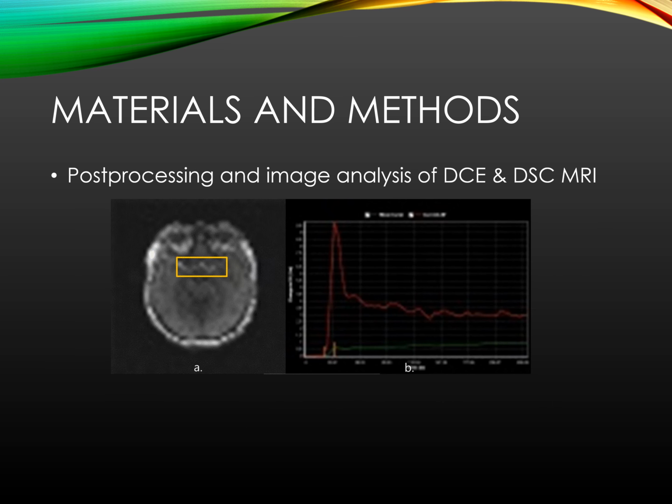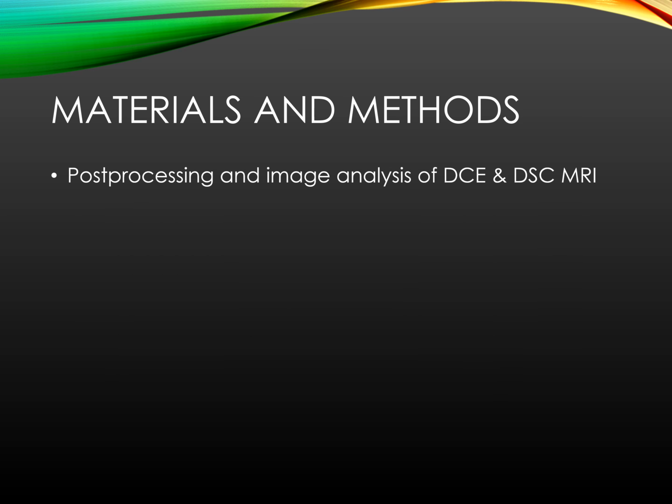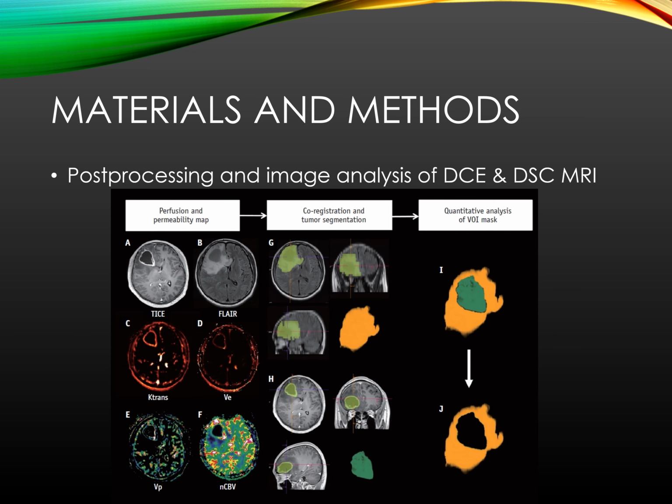This figure illustrates the schematic diagram of the image processing. Two reviewers manually determined the arterial input function, AIF, by locating an ROI at the Circle of Willis or distal ICA that produced the best fitting AIF curve and concentration time curve. Afterward, the K-trans, Ve, Vp maps of DCE MRI and normalized CBV map of DSC MRI were computed and co-registered with the contrast-enhanced T1 weighted image and FLAIR images.